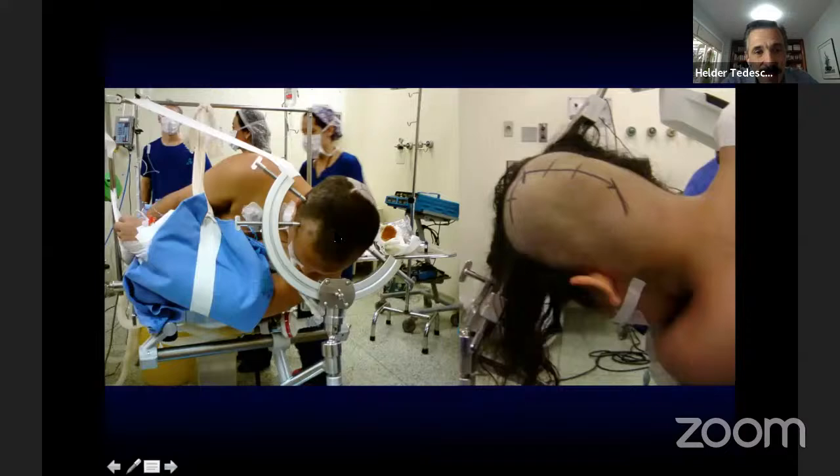We can operate it seated on the side. I will start with the interhemispheric occipital transtentorial approach. You can be sitting here comfortably. You don't have to stretch your arms, and this is a very comfortable position. Make sure that you place your patient very close to the edge of the table so that you don't have to stretch your arms. It will be very, very close to you.